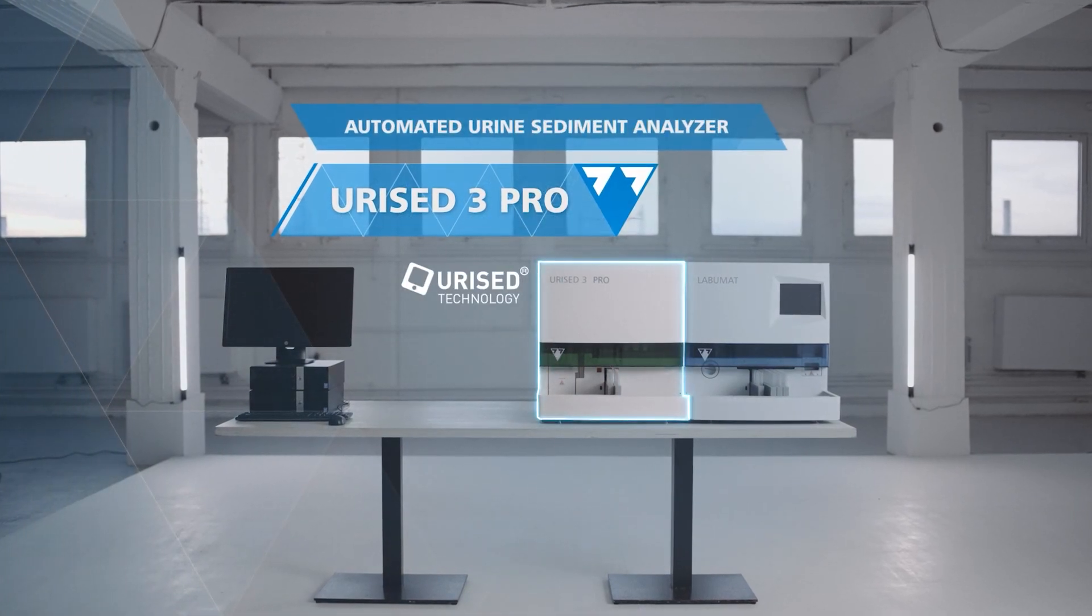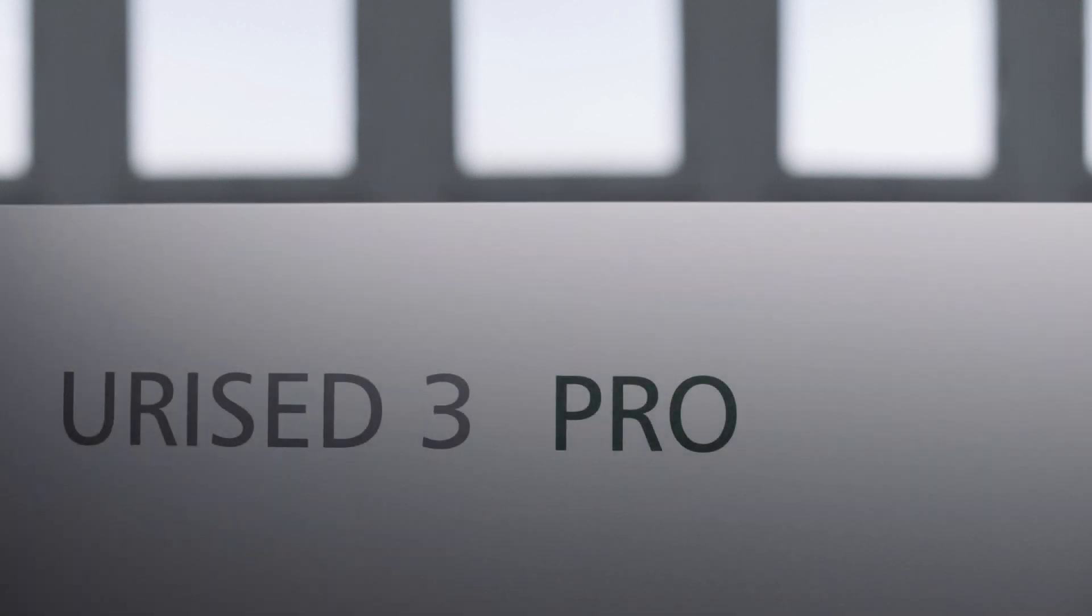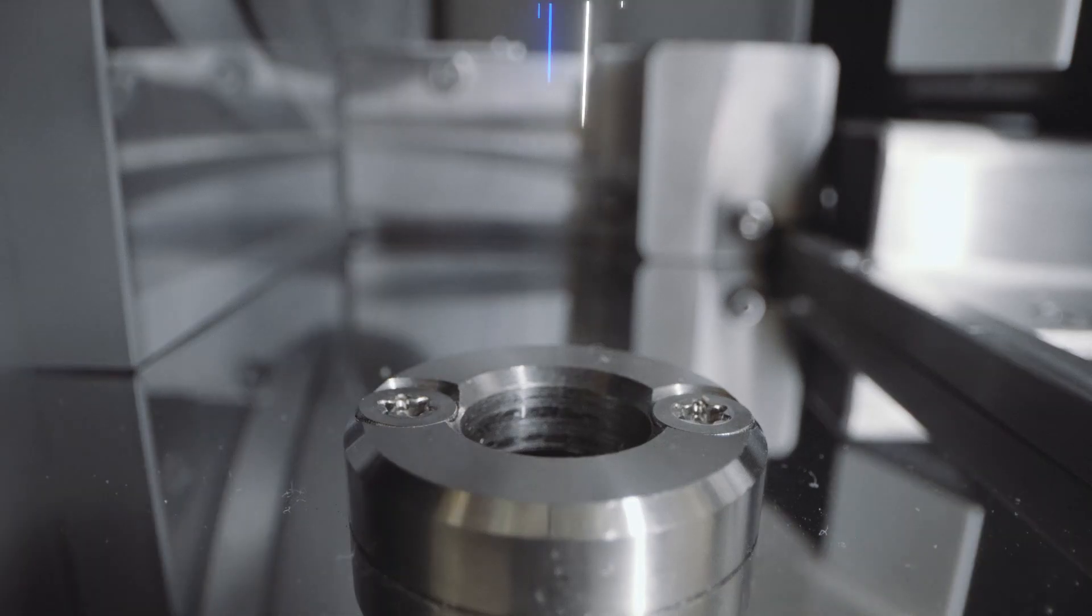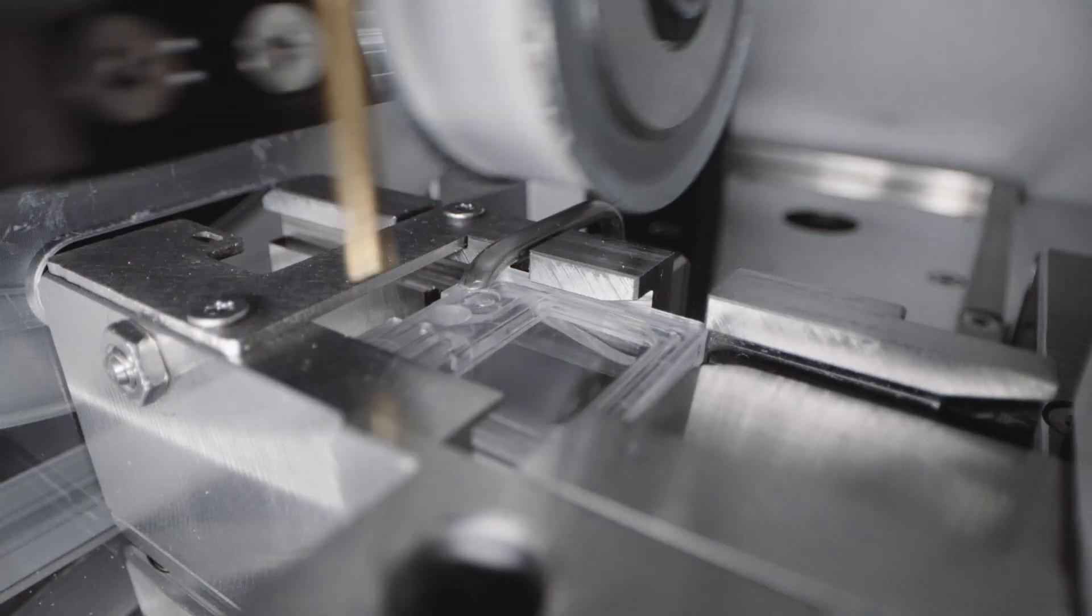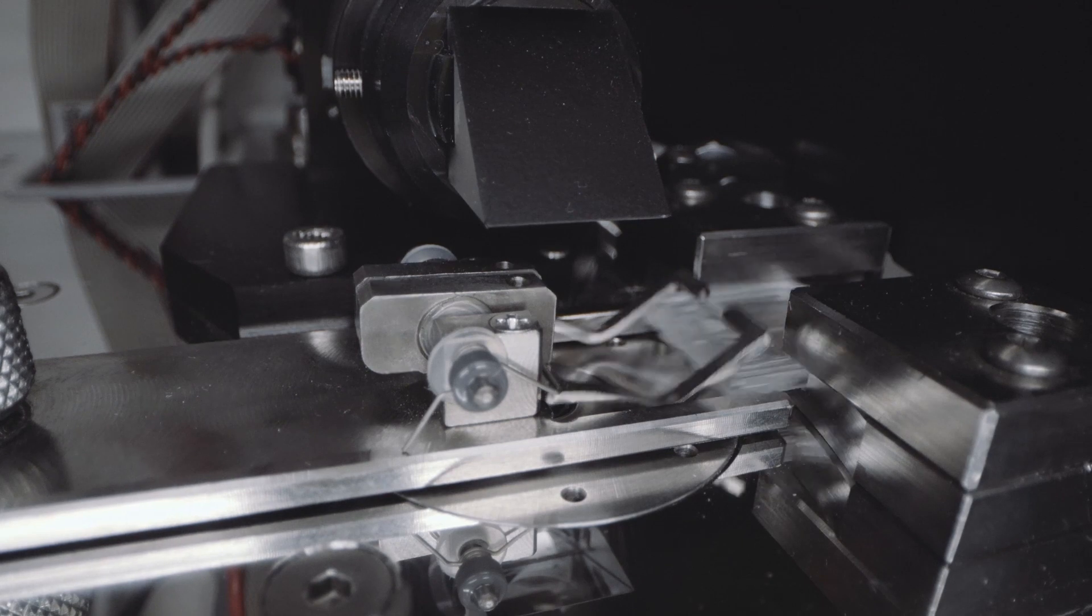UriSed 3 Pro is an automated urine sediment analyzer with a revolutionary new optical system combining bright field and phase contrast microscopy, analyzing native urine in a special counting chamber and providing results for 18 different parameters.